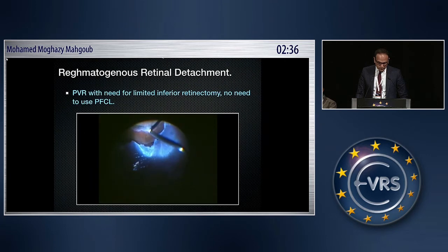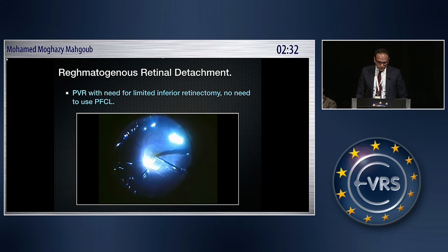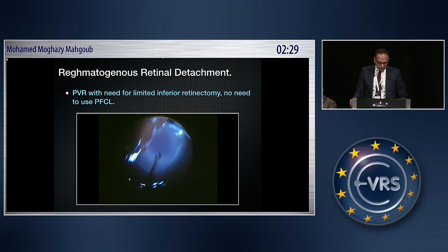Another case with an inferior giant retinal break — you don't need to use PFCL. This patient also had a macular hole, and you can manage the inferior retinal break and retinectomy entirely under air.